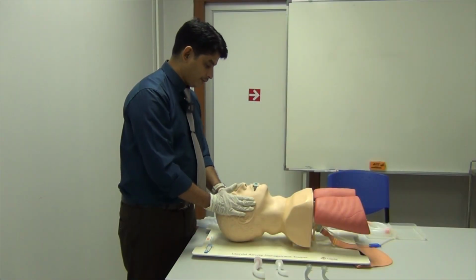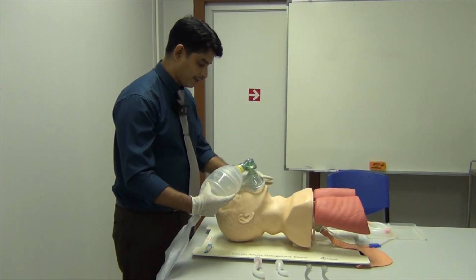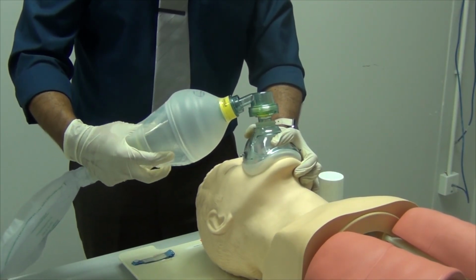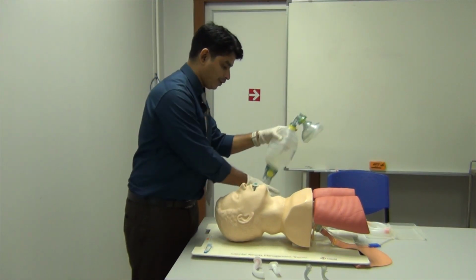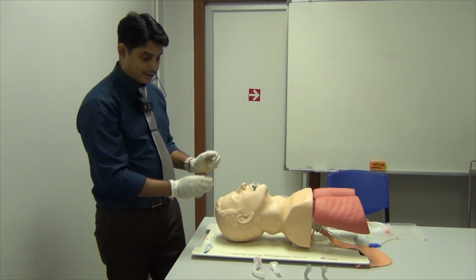So once you have secured it, you can give oxygen by a face mask. In this video I am using an ambu bag. So I am giving oxygen. You can see the expansion of the lungs. So this is how you overcome an obstructed airway, especially the tongue in unconscious patients without a gag reflex.